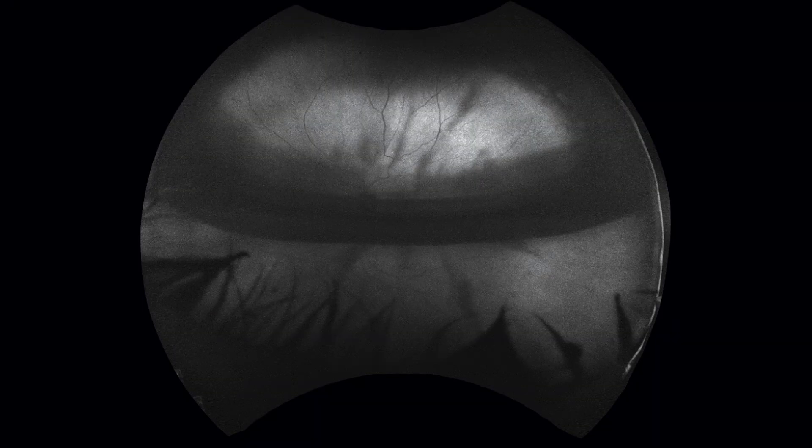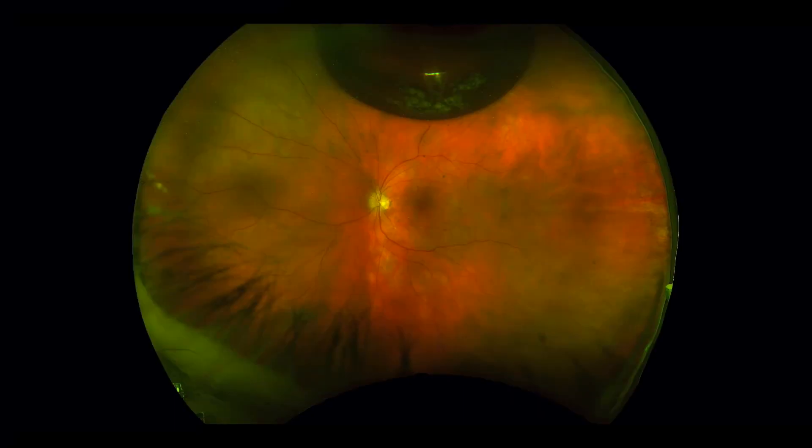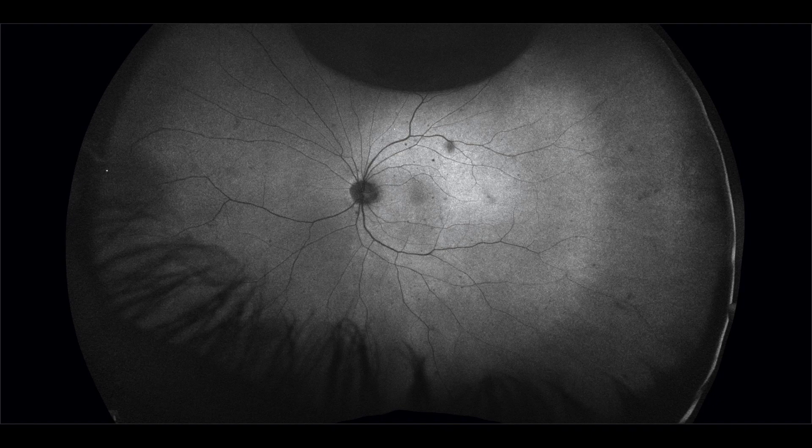This is the appearance of the eye one day after the surgery with about 50% gas fill. This is the appearance one week after the surgery with only minimal gas remaining and the retina is flat. This is the autofluorescence one week after the surgery with no retinal displacement seen.